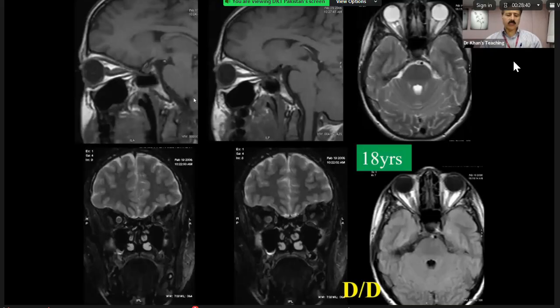Now, the teaching point here, we are into phakomatosis. If you ask me what is the most important subject in the FRCR 2B CNS, it's phakomatosis. More cases come from it than anything else. Some of these aren't many cases which at times they don't like to show nowadays.